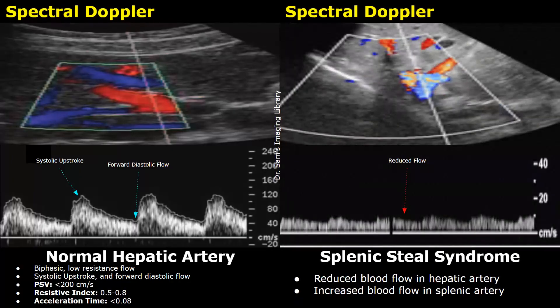In this case of splenic steal syndrome, we find an overall reduced blood flow in the hepatic artery. We cannot see a significant sharp systolic peak — a very small peak is noted, which corresponds to only 10 centimeters per second. The smallest amplitude can be considered the EDV. It is a very sluggish flow.